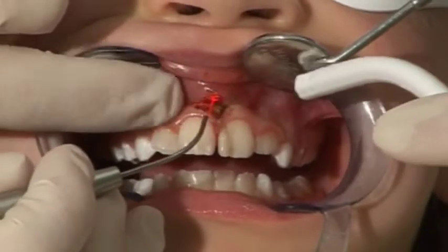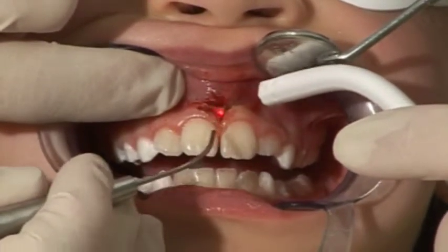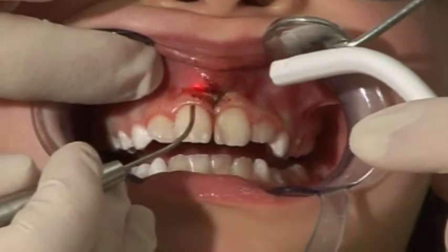When cutting through soft tissue, proteins may accumulate on the tip of the fiber causing it to carbonize. If this happens, remove the carbonization residue from the fiber tip or shorten the fiber.